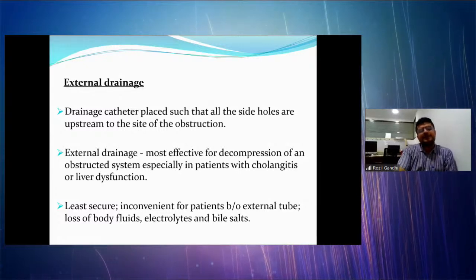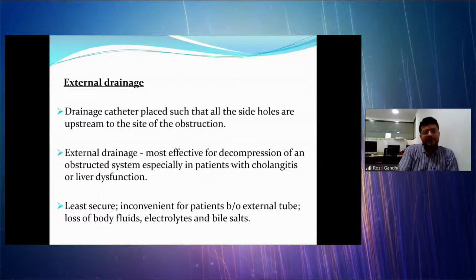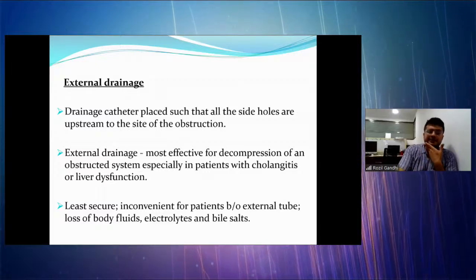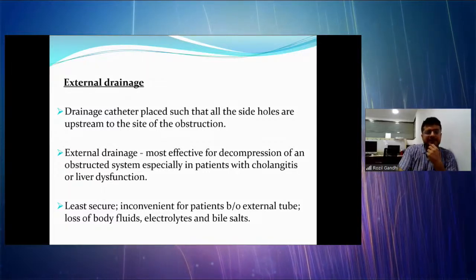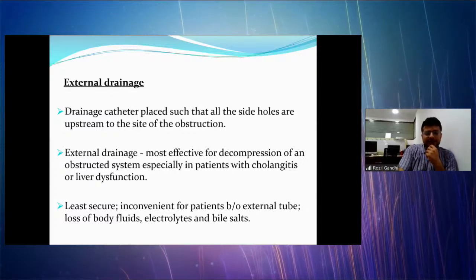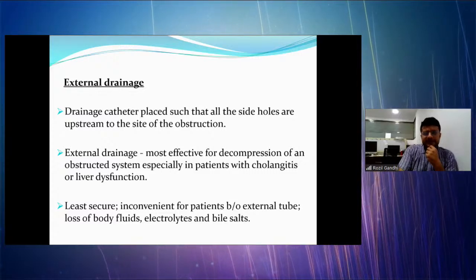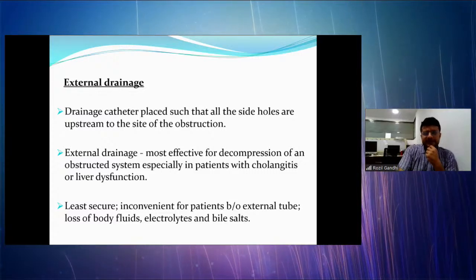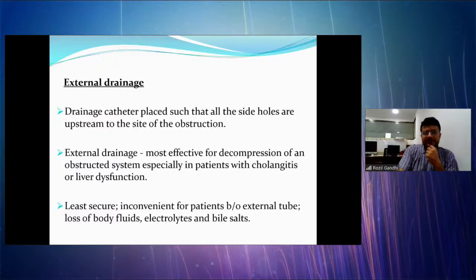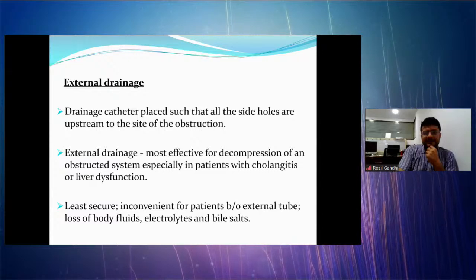As I explained, external drainage has the holes only proximal to the occlusion. It is least secure and less length of the drainage catheter is there inside the body. So there is a chance of accidental removal or accidental displacement of the catheter. And it can be clamped.